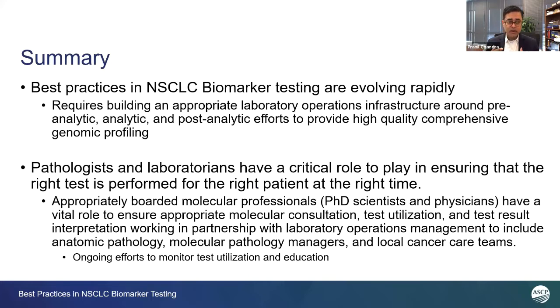It's a very complex process, and every institution is different. But it's important to know that the best practices for lung cancer biomarker testing, they are evolving very rapidly. And this does require building an appropriate lab operations infrastructure to address the pre-analytic, analytic, and post-analytic efforts that are necessary to provide comprehensive genomic profiling or molecular testing, whatever is specific to your institutions. And in that role, laboratorians, pathologists have a really critical role to play in making sure that the right test is performed for the right patient at the right time.